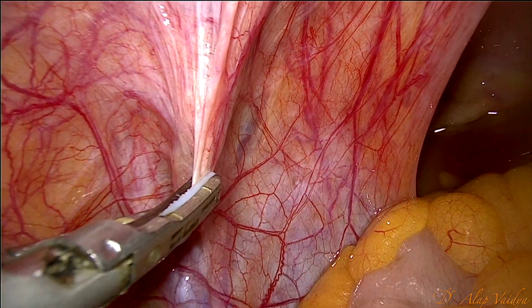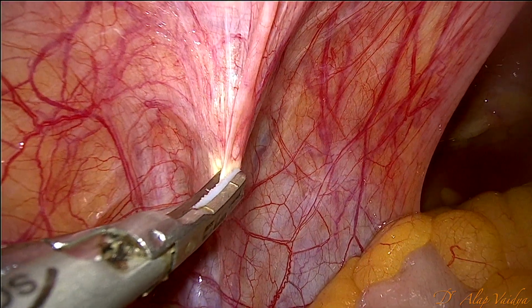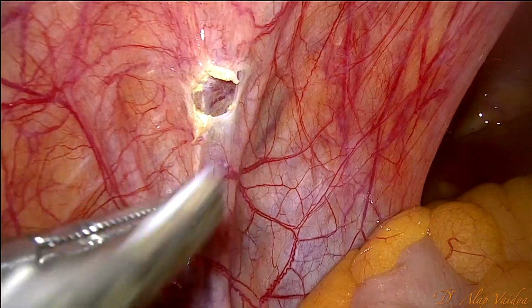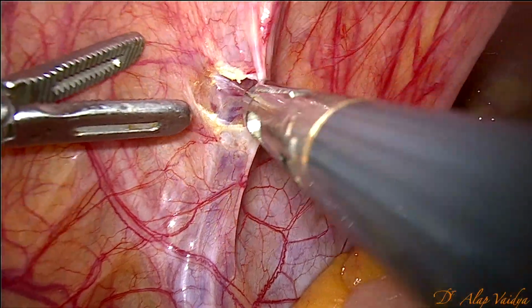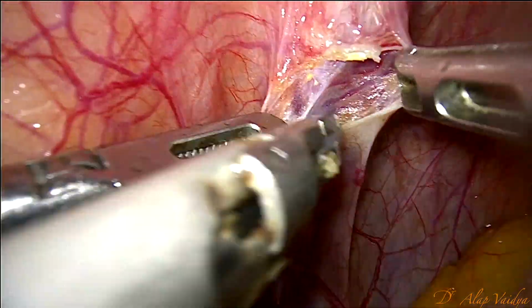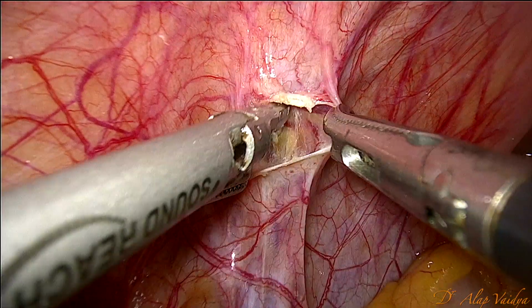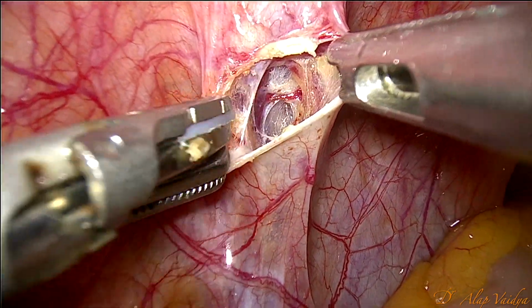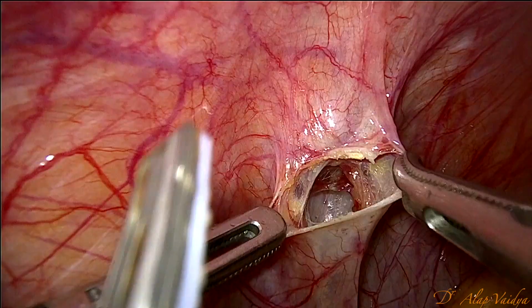Put a small nick and make a window. Hold and stabilize the window, then give parallel strokes on both sides of the uterine artery.